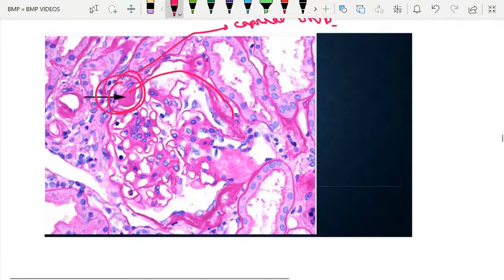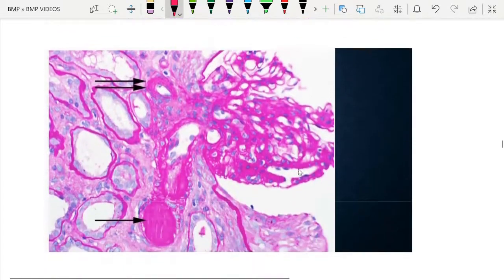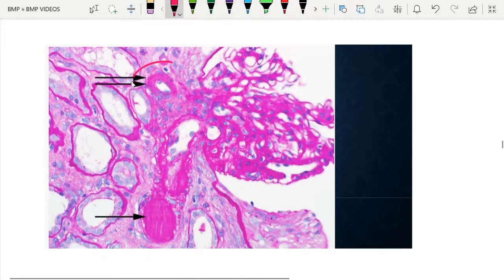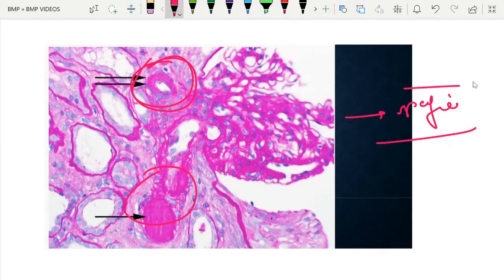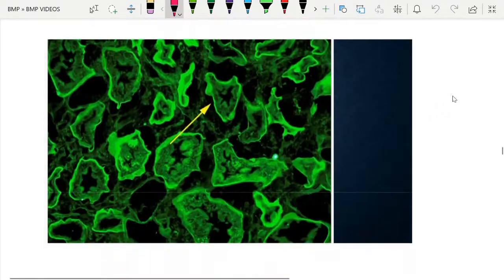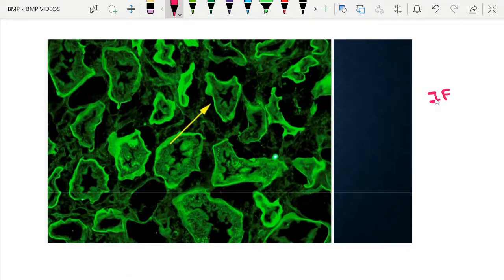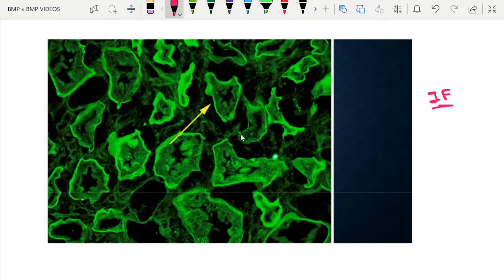Another image shows hyaline accumulation in the afferent and efferent arterioles — the specific finding for diabetic nephropathy. Regarding immunofluorescence, there may be non-specific IgG trapping, which is shown here in the tubular basement membrane.